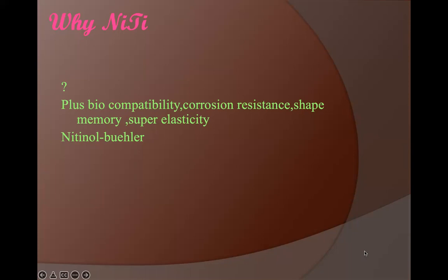shape memory and super elasticity, which makes it a unique one, and that is why it is mainly used in endodontics. And the first nickel titanium wire was introduced by Buehler, and it is termed as nitinol, which was developed by Naval Ordnance Laboratory.